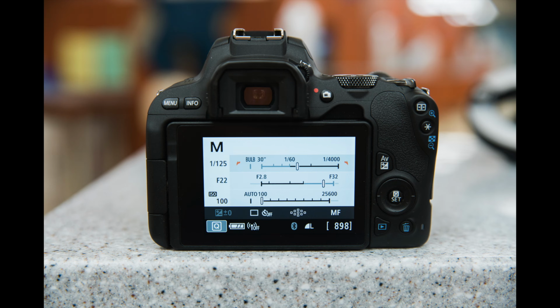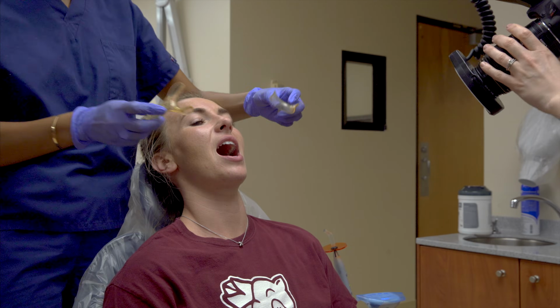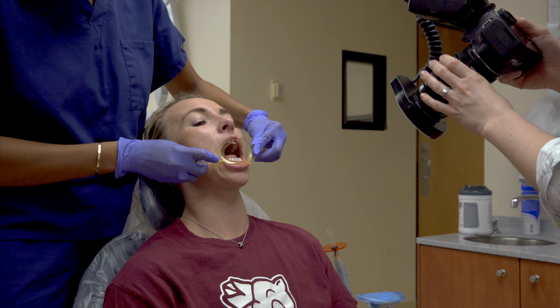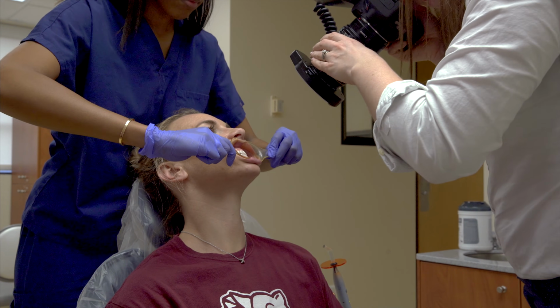To do this, set your camera to f22, speed 1/125, and ISO 100. Make sure both sides of your flash are on. The additional gear that we use for the standard adult patient and photography set include a set of plastic cheek retractors, metal cheek retractors, the 1B, 2B, and 4XL mirrors.